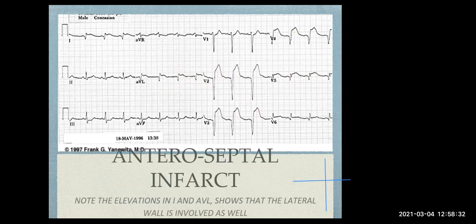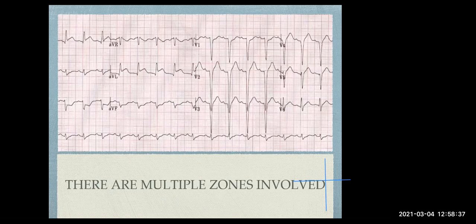So let's look at another example. So we say anteroseptal, lateral. All right, not a problem. So this is a scary ECG. If you want to challenge yourself, pause now, and then let's take it from there.